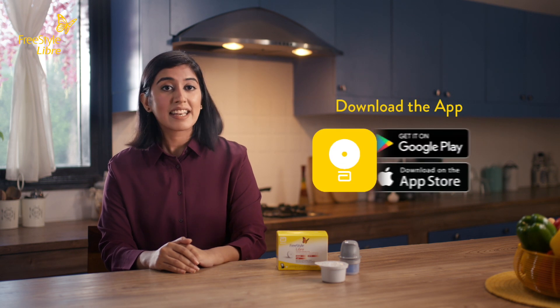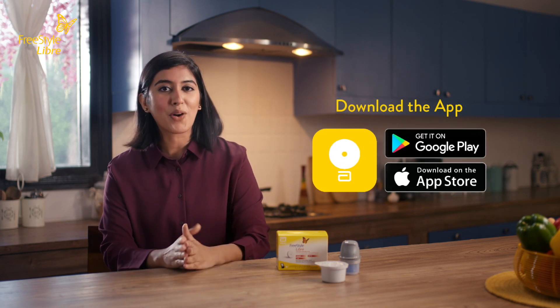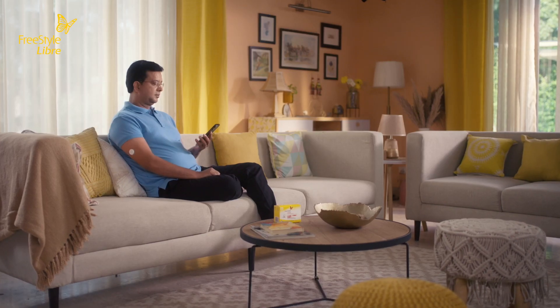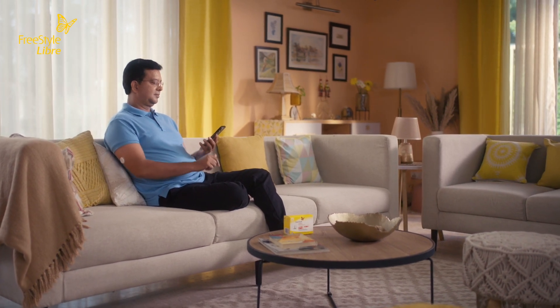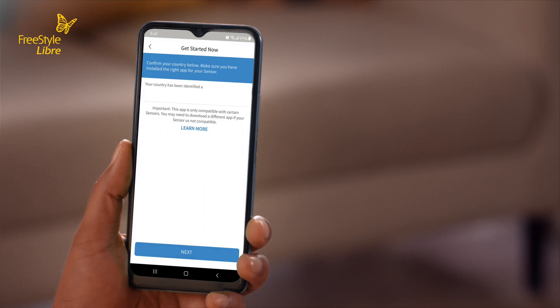To get started, download the Freestyle Libre link app free from the App Store on your iPhone or Google Play on your Android smartphone. This app allows you to check your glucose levels simply from your smartphone. Once the app is installed on your mobile phone, open it to get started. You will have to enter some information to get your app set up and ready to use.